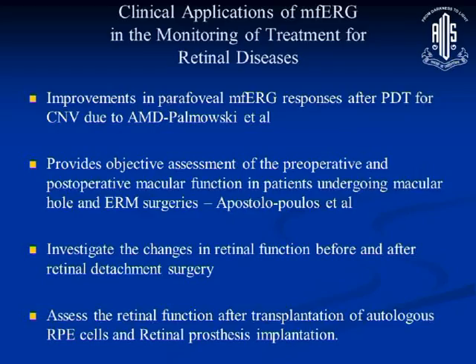Clinical application of multifocal ERG in monitoring of treatment for retinal diseases: we see the improvement in the parafoveal MFERG response after PDT for CNVM due to AMD. It provides objective assessment of the preoperative and postoperative macular function in patients undergoing macular hole and ERM surgery. It can investigate the changes in retinal function before and after retinal surgery, retinal detachment surgery, and it can assess the retinal function after the transplantation of autologous RPE cells and retinal prosthesis implantation.